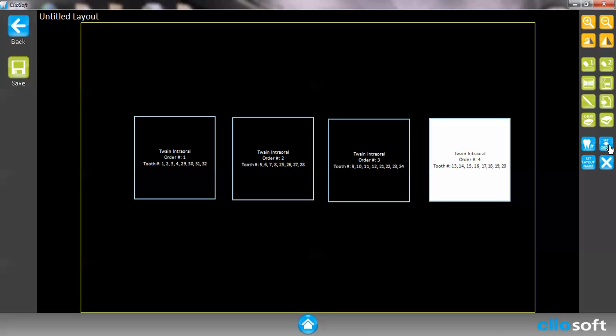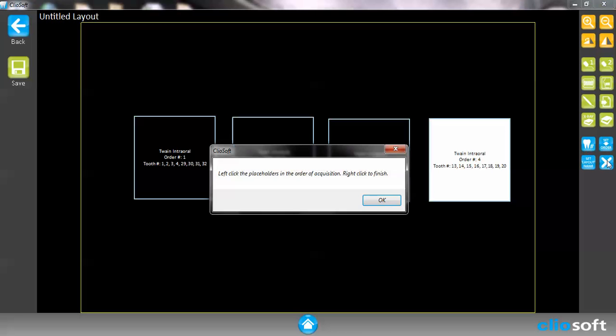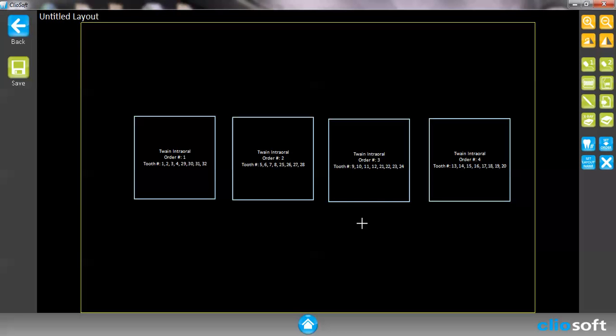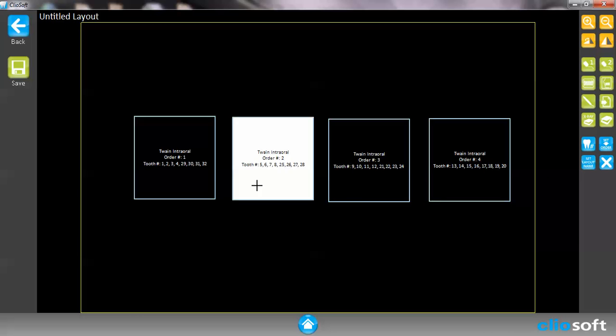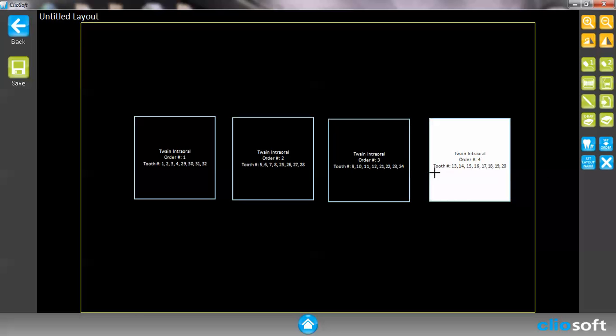And then I can also set the order sequence in which these images are going to take. So if I were to use an automatic feature, I'll set order one, two, three, and four. Now I'm going to go ahead and, okay that's good. One, two, three, four. Okay.